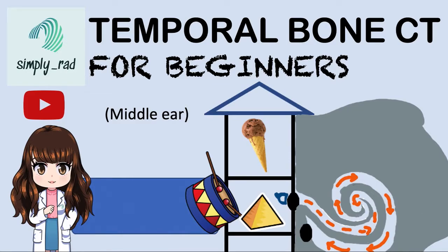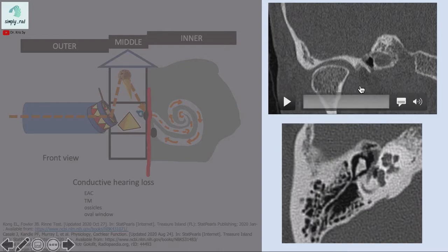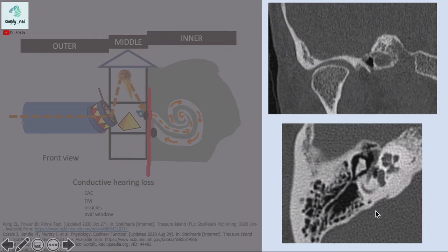Good morning. We're going to cover temporal bone CT for beginners today. The temporal bone is the smallest and most complex structure we can evaluate on CT. The most basic views include the coronal view on top and the axial view at the bottom. To organize our search pattern, we are first going to scroll through the coronal image.